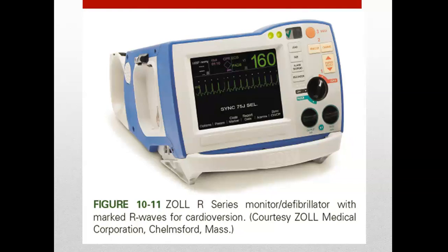So synchronized cardioversion is really the treatment of choice for those hemodynamically stable VTACs and some atrial dysrhythmias, AFib and aflutter and things like that. When the patient is stable, we have time to synchronize that defibrillator to that patient's intrinsic electrical conduction so that we can deliver that shock at the time of the QRS.